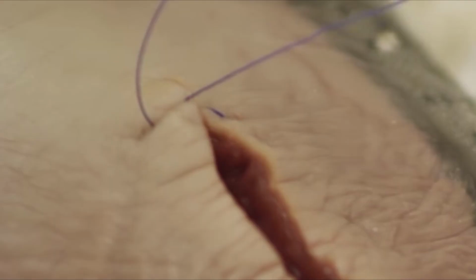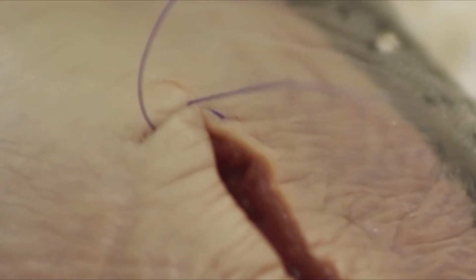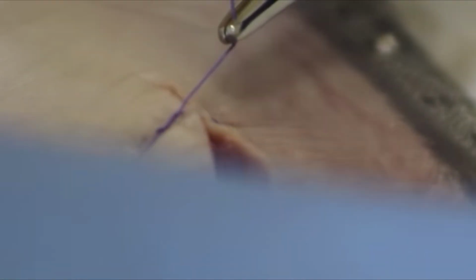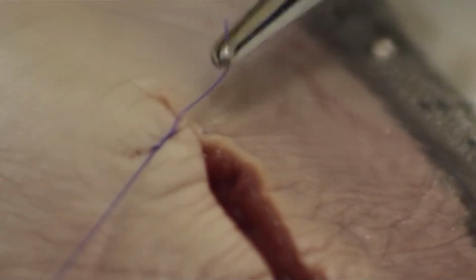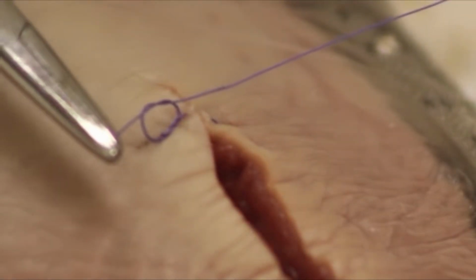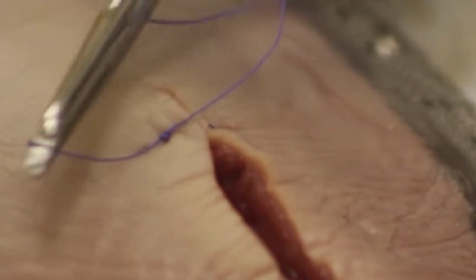Now the stitch is tied. Maintain alignment and set tension gradually. The first throw is a surgeon's knot, wrapped twice, to hold tension while the knot is seated. Pull in line with the wound so the edges approximate without strangulation. Then add alternating throws to form a square knot and secure the stitch. Each throw should be seated flat, with even tension on both strands.